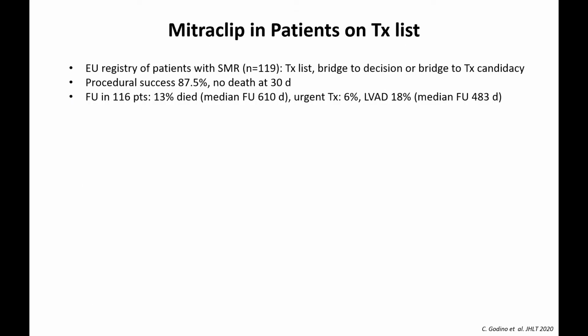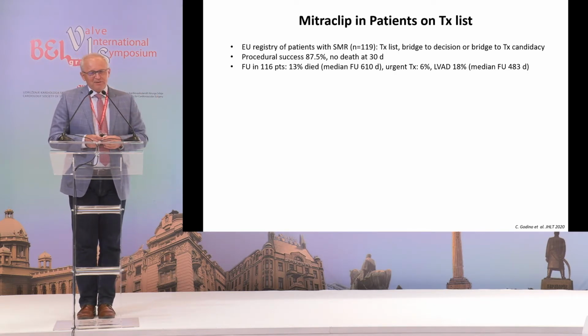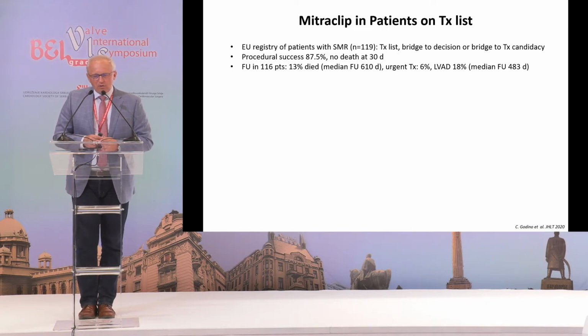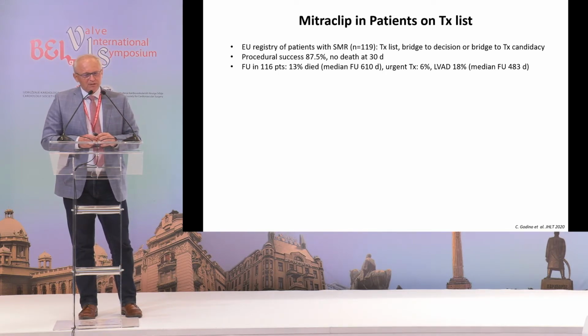The second is coming here. It is basically, can the MitraClip be used beyond the classical criteria of COAPT and MITRA-FR? And this is a nice registry from European centers, basically reporting the use of the MitraClip in patients who are on the transplant list. Either transplant list, or bridge to decision, or bridge to transplant candidacy.